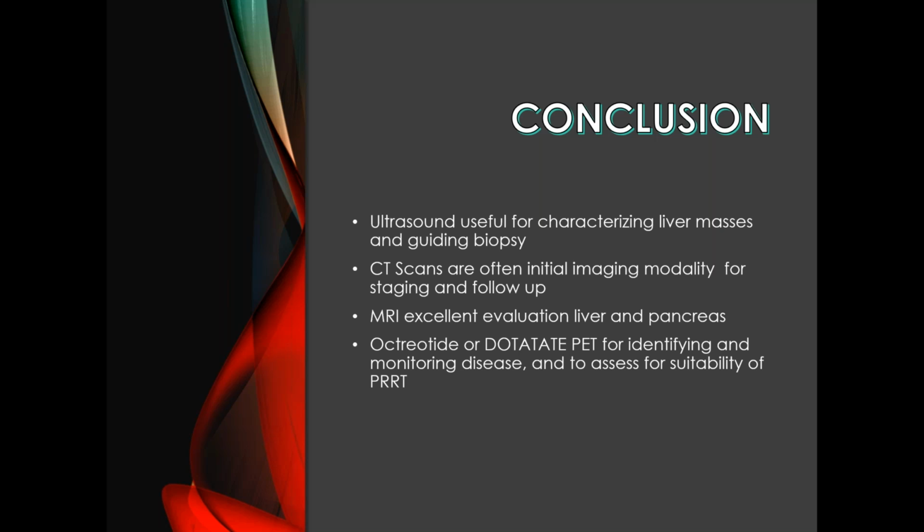Sometimes some patients are also claustrophobic. So you might have to gate the MRI, for example. So it just depends where it is. We have used it to troubleshoot things in the mediastinum, tumors in the mediastinum, but really CT scan is excellent for the lungs, and it's so widely available. So CT scan is pretty much your primary modality for the lungs.